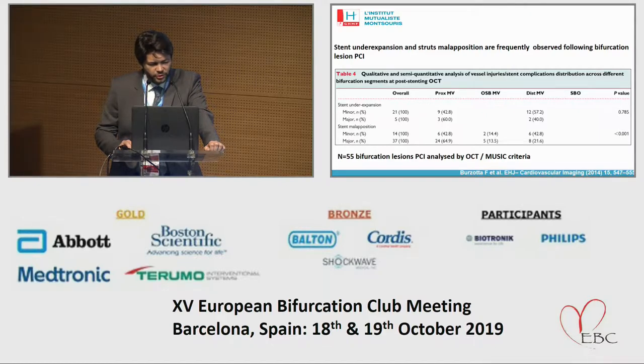As you all know, under expansion and strut malapposition are frequent findings in bifurcation lesion PCI. For example, this series by Francesco Burzotta and colleagues explored 55 patients with bifurcation and OCT analysis, applying the MUSIC criteria. As you see, the authors reported that stent under expansion was observed in almost one half of the patients and stent malapposition in almost all patients.